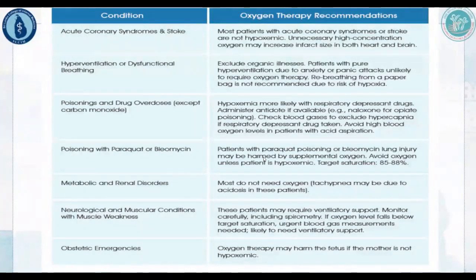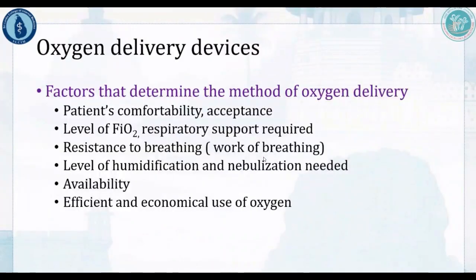Patients with metabolic problems and poisoning don't always need oxygen. Right, so we talked about prescription and administration, what the targets are, and when to administer oxygen. Let's talk about oxygen delivery devices.